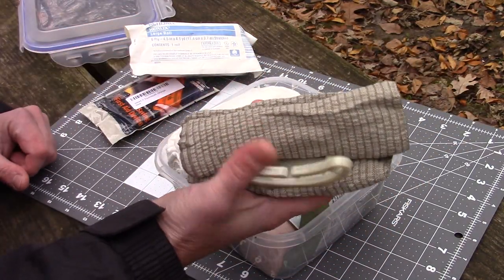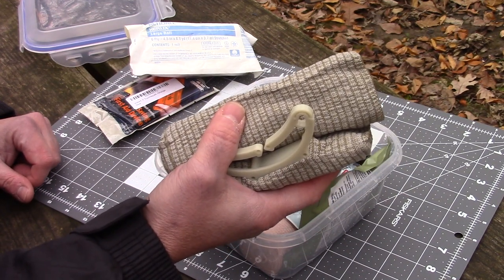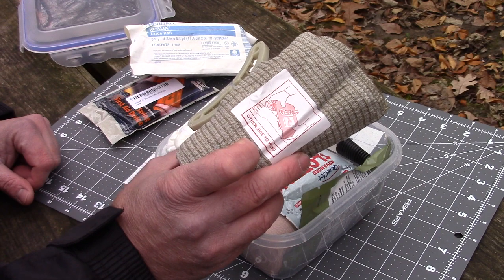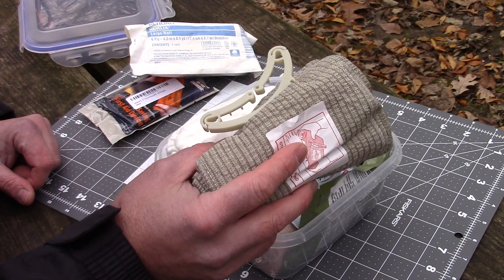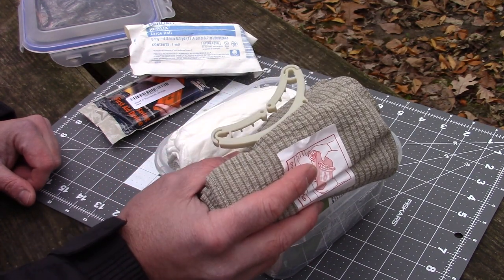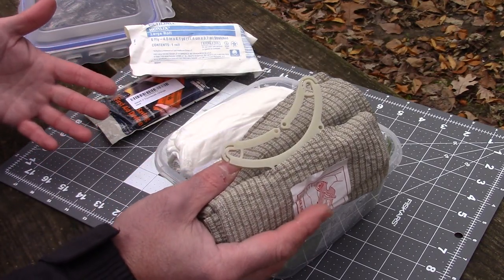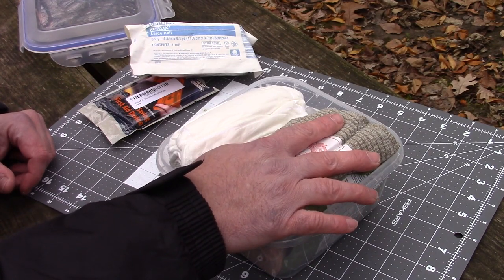A lot of people see this and they say, 'Well, that's not sterile.' These aren't really meant to be sterile - you just don't want them to be dirty. They're meant for stopping the bleeding and getting you to a hospital. If you picked up a couple germs along the way, the hospital can give you some antibiotics. The key thing is having something right there that's open and ready to go so you don't have to fumble with it.